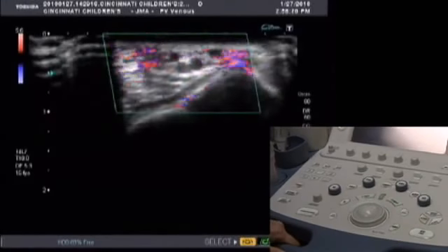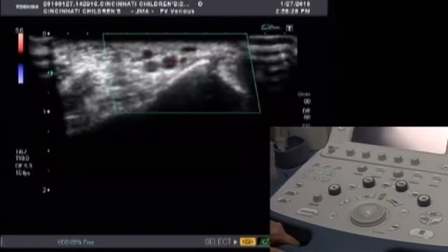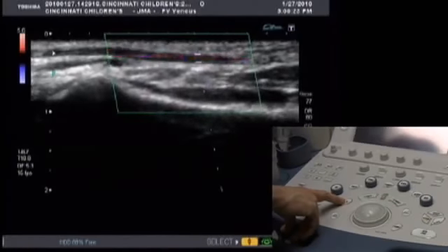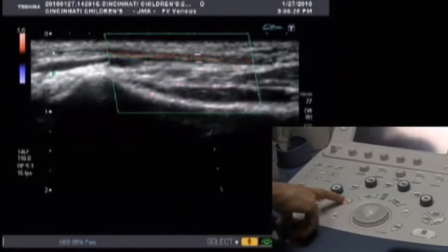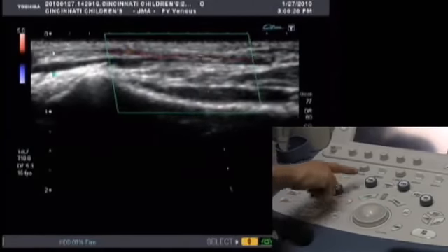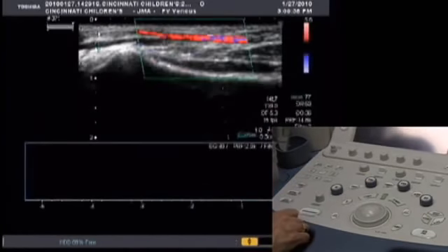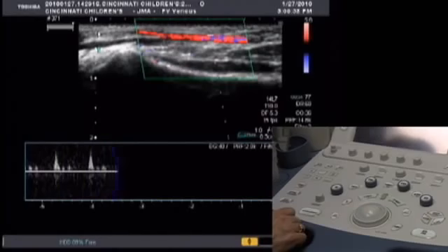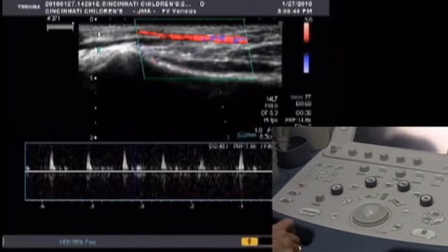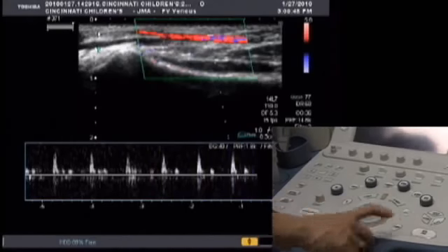Now that you've optimized your image, we're going to scan in the longitudinal plane to obtain the pulse wave. Select your gate by pressing the gate button, then use the trackball to move the location of your gate over the artery. Press Pulse Wave to activate the Doppler display. Quick Scan will autofocus or clean up your baseline image. Then press Freeze to capture the image.